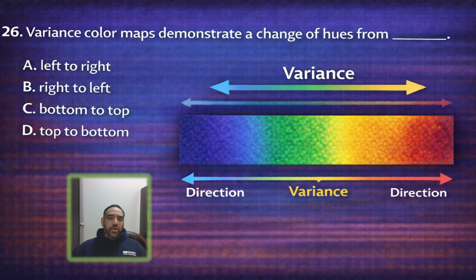So think of the color bar like a rainbow stretched sideways. Velocity correlates to brighter or darker versions of the same color. Variance correlates to color shifts sideways into the green yellow mosaic tones. And that sideways shift is left to right.